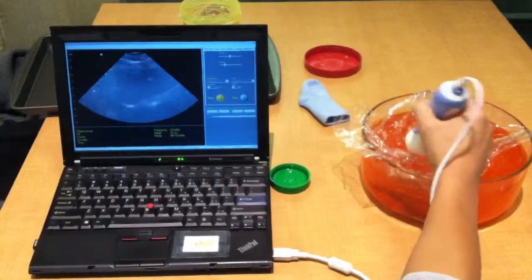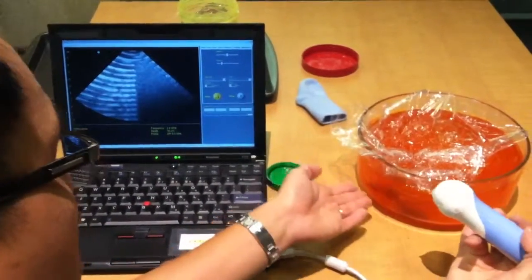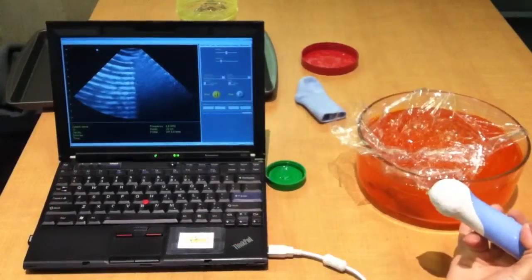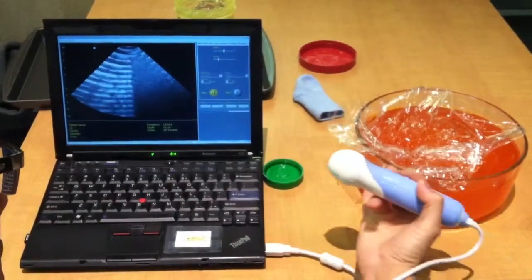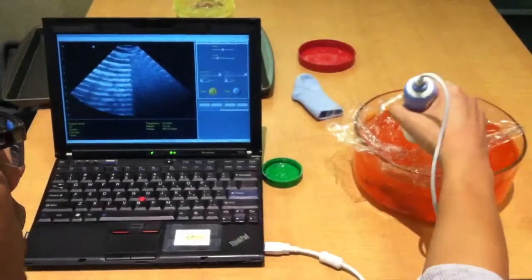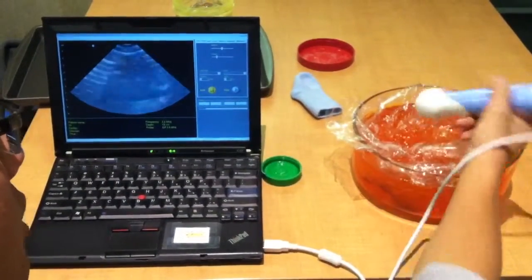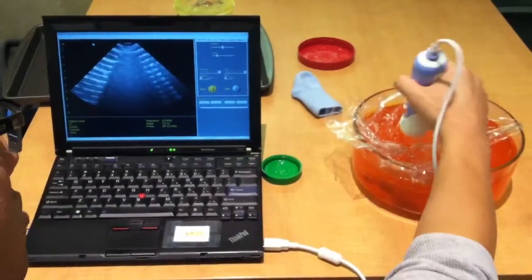So now we're scanning our first prototype of the simulator, and this is basically gel and some stones inside — gel to simulate the amniotic fluid, some stones just to see what we can see. And here we just have a plastic covering, and we have a probe, a 3.5 MHz probe.